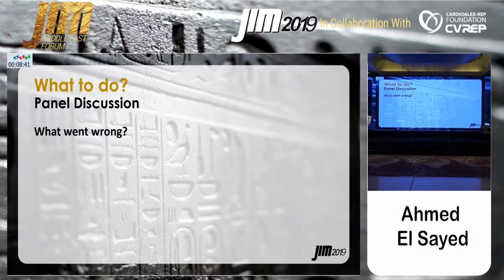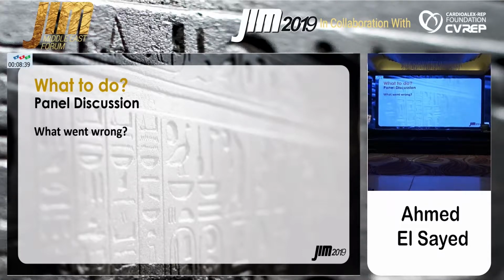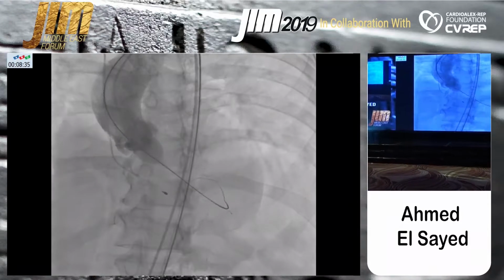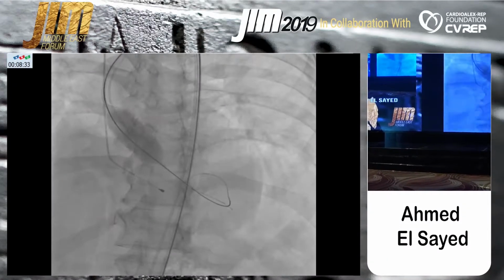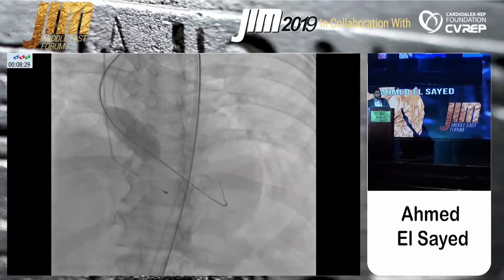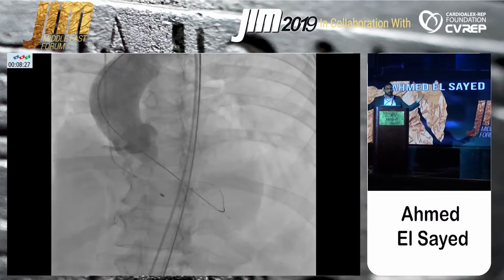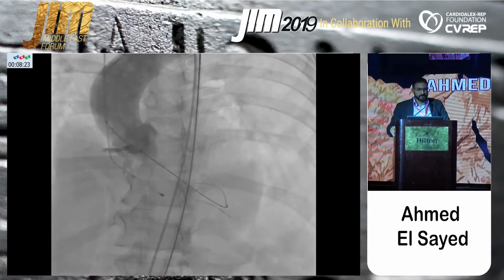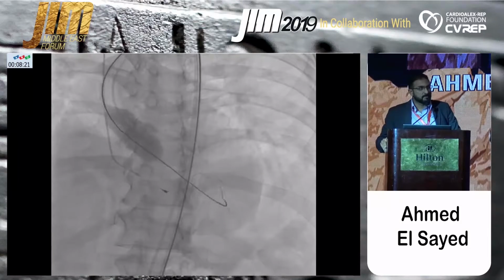After the patient was back again, we decided, as we previously planned, to do simultaneous aortic angiography with the balloon inside to check that there was no coronary occlusion with the displaced leaflet. But what was really interesting was that there was a staining in the right coronary artery.